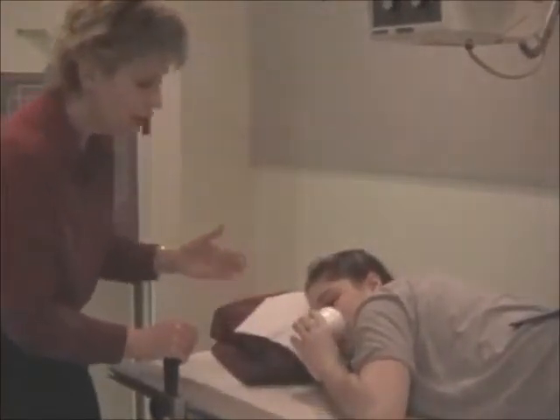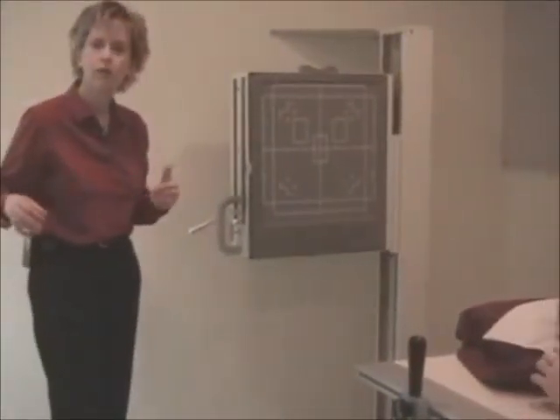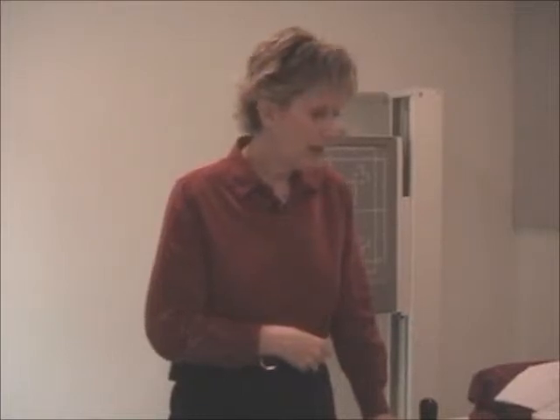She actually has a straw, and then you'd go to your exposure panel and okay, taking another big mouthful, swallow it, and you're trying to watch the epiglottis, and recommend on about the 4th swallow, you watch the epiglottis, and when it moved up, the esophagus opened up and the barium went down. So you try to press the expose button at the time that you see the epiglottis go into a vertical motion. And hopefully we catch the barium in the esophagus.